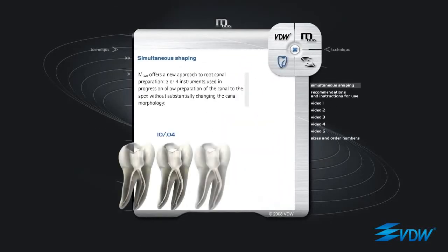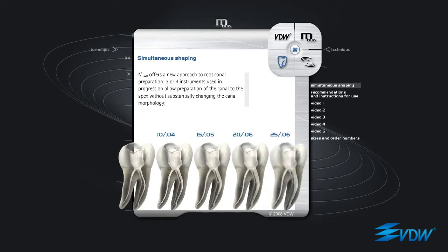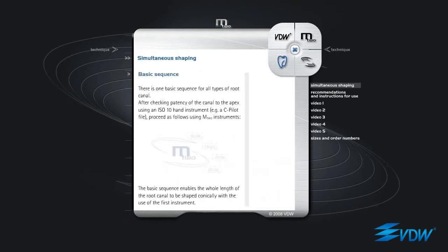Simultaneous shaping. M2 offers a new approach to root canal preparation. Three or four instruments used in progression allow preparation of the canal to the apex without substantially changing the canal morphology. Basic sequence.